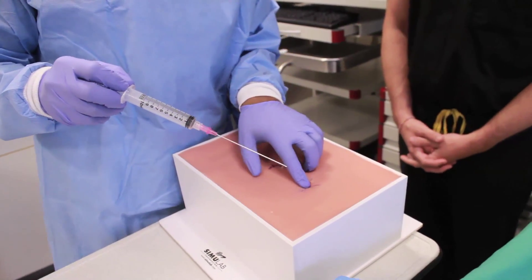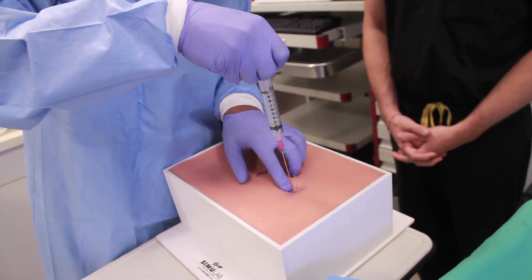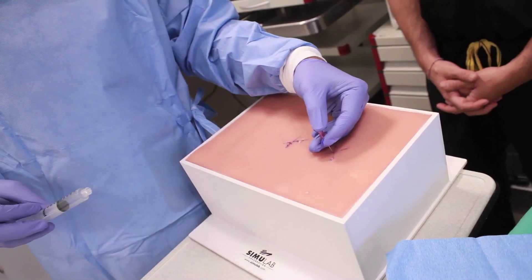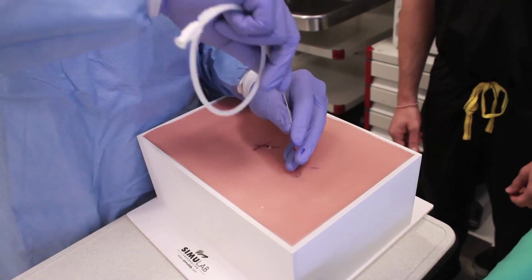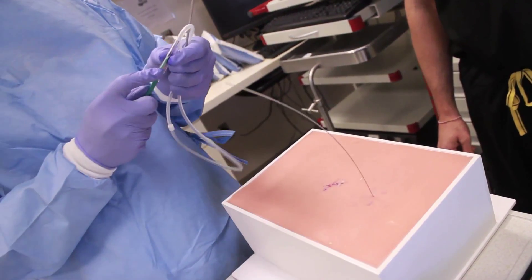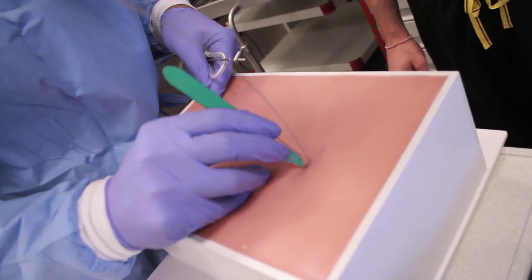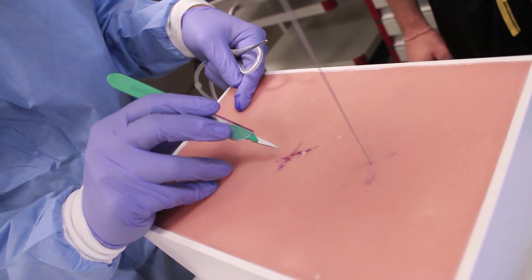Using a finder needle connected to a 10 ml syringe, feel between the rib spaces at the X marked by landmarks and ultrasound. Using negative pressure on the syringe, insert the needle until you get a flashback of fluid. After finding the fluid, place your finger over the hub to prevent entry of air or fluid. Then insert the guide wire through the needle into the pleural space and remove the needle. Now use the scalpel to make a one to two centimeter incision around the wire, and also around the entry point where the tunnel catheter will be placed.